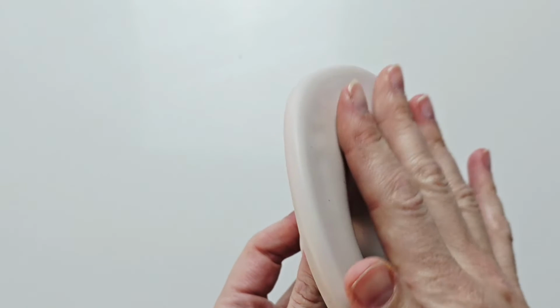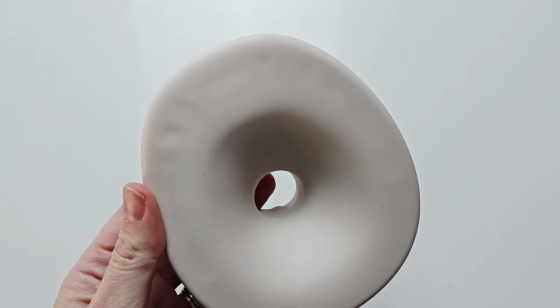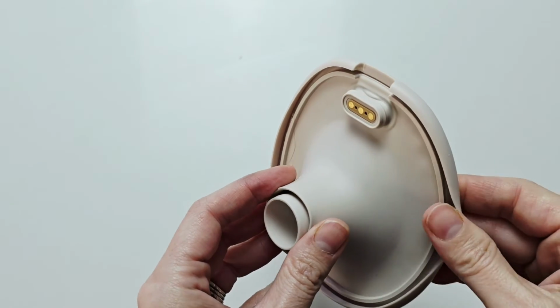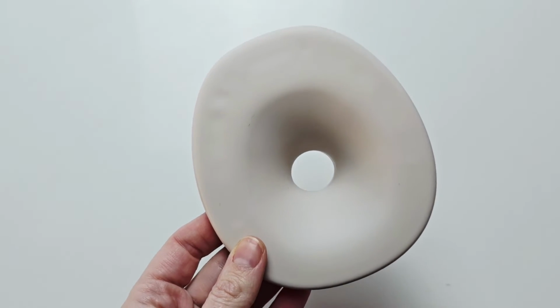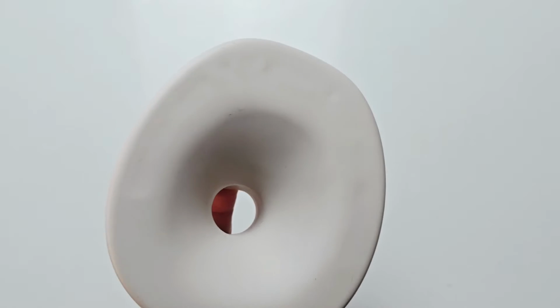And you might also find heat temperatures can impact this. If you're using the fridge hack and then it goes into a sterilizer, those changes in heat can impact the durability of your flange, so it might wear a little bit quicker. So around the 3 to 4 months, if you notice any damage, then replace your flange.